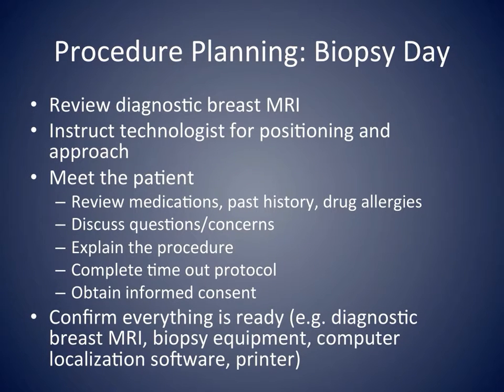The day of the biopsy is when the radiologist reviews the diagnostic breast MRI again and instructs the technologist about patient positioning and lesion approach. When meeting the patient, it's important to review her medications, medical and surgical history, allergies to medications, and answer any questions or concerns she may have. It is also very important to explain to the patient the procedure well, including the possibility of canceling the biopsy if the lesion is no longer seen.